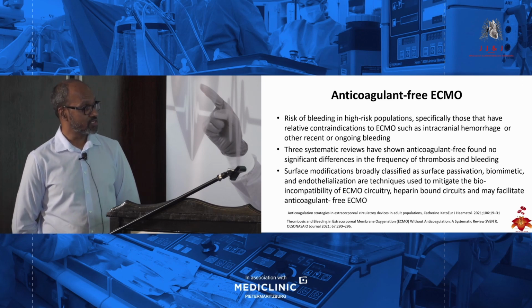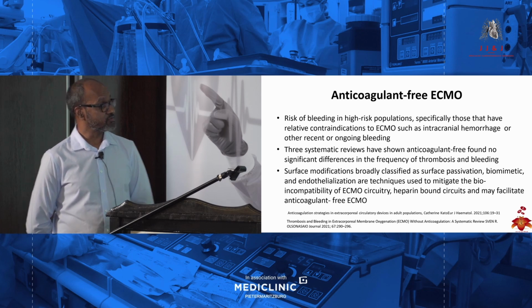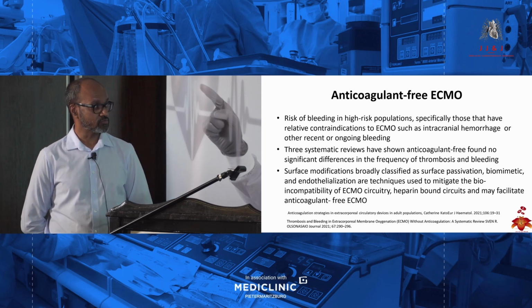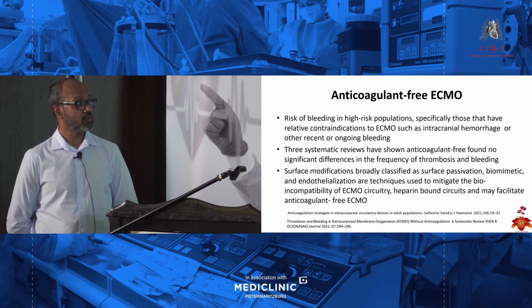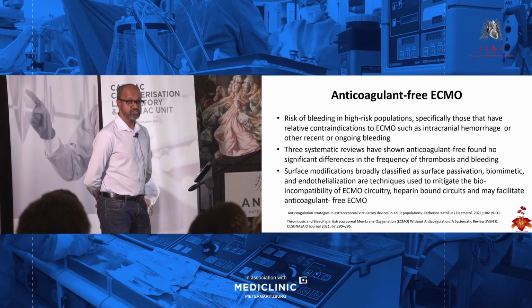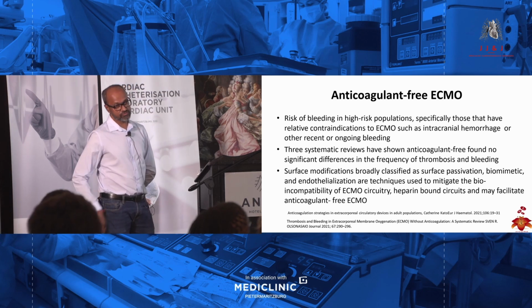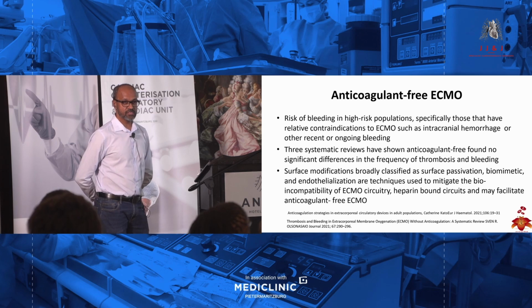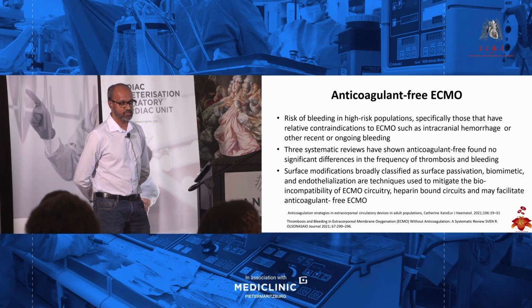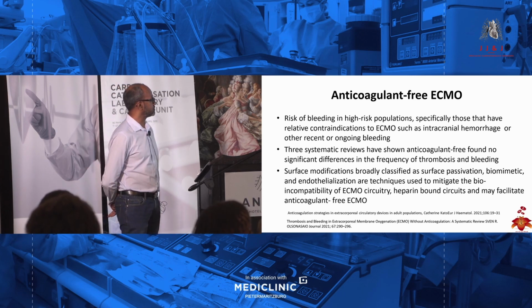Surface modifications, broadly classified as surface passivation, biomimetic, and endothelialization, are techniques used to mitigate the bioincompatibility of ECMO circuitry. Heparin-bound circuits may facilitate anticoagulant-free ECMO. In some of these studies, they showed you could go up to 4.75 days without using any anticoagulant. Obviously, you prime your circuit, but after that, 4.75 days with no anticoagulant, and the results are similar in the anticoagulant versus the non-anticoagulant units.